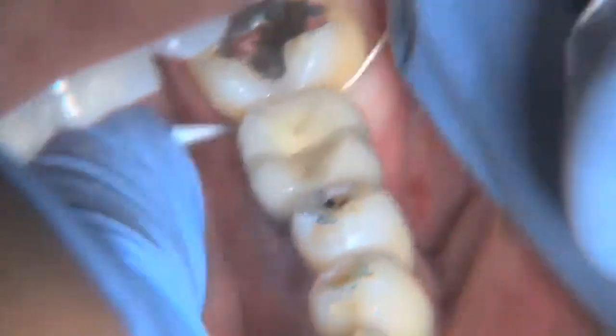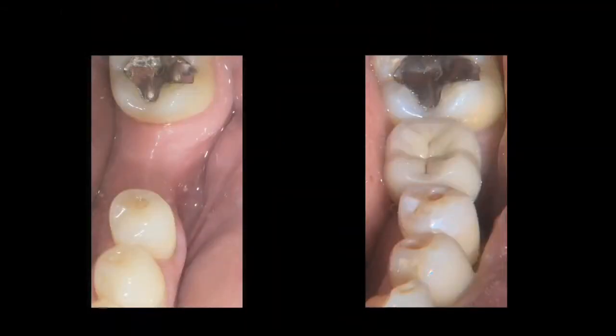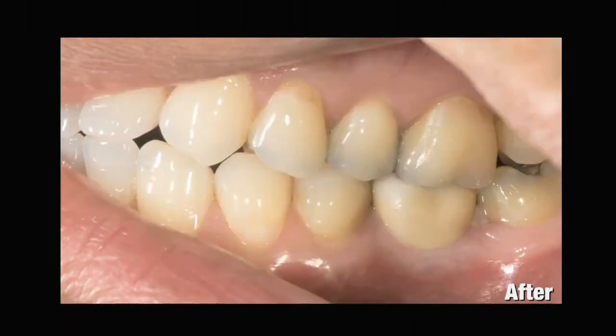It is critical that all excess cement be removed. This case demonstrates several new technologies available through Glidewell Laboratories, including digital treatment planning and CAD/CAM custom abutment design and fabrication. It also illustrated that guided surgery is not synonymous with flapless. When it is appropriate, ancillary procedures such as grafting can be easily accomplished in conjunction with guided implant placement.